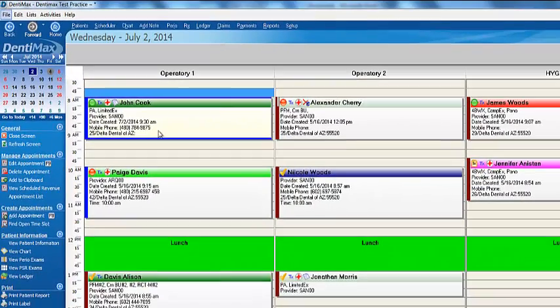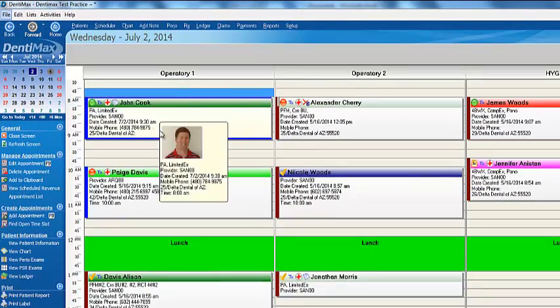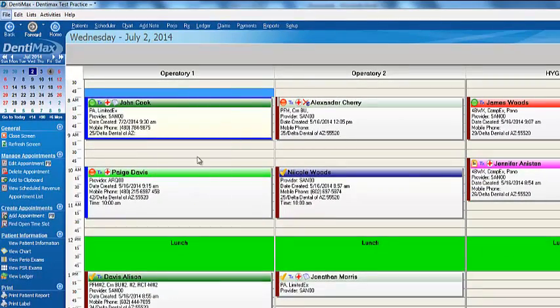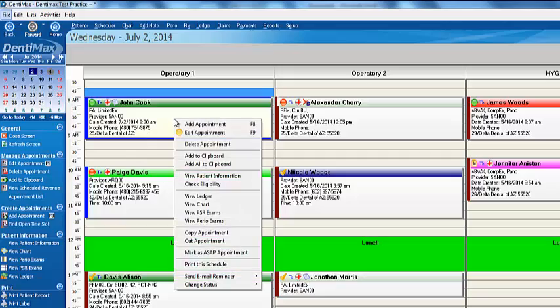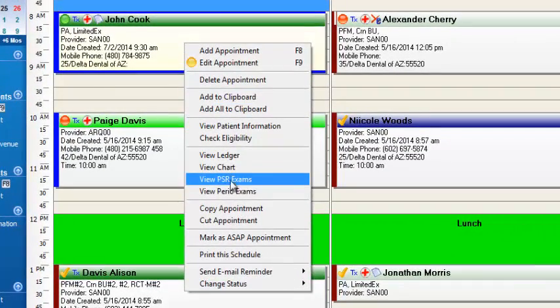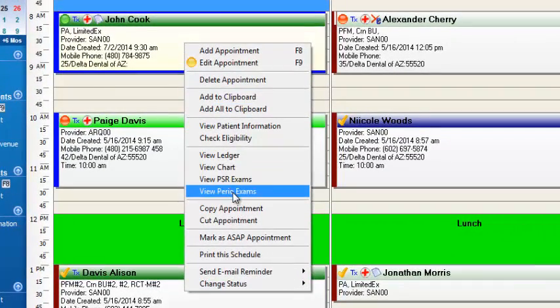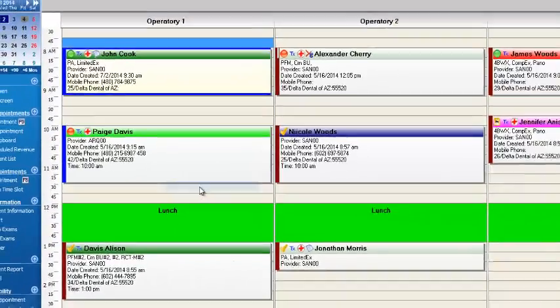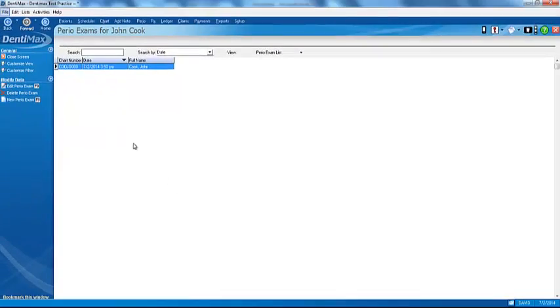My preferred method is just to go to the appointment, right-click on it, and all the available options appear — including view perio exam. So I'm going to go ahead and select that option.